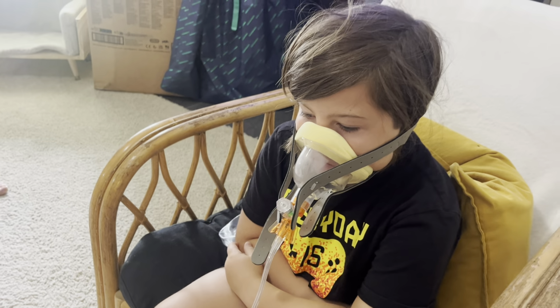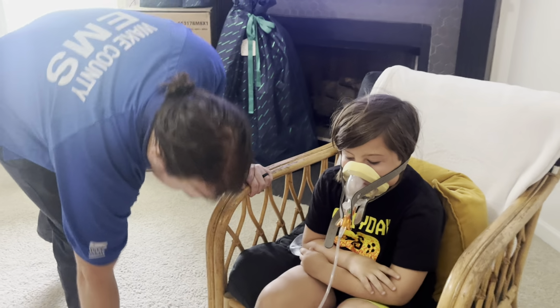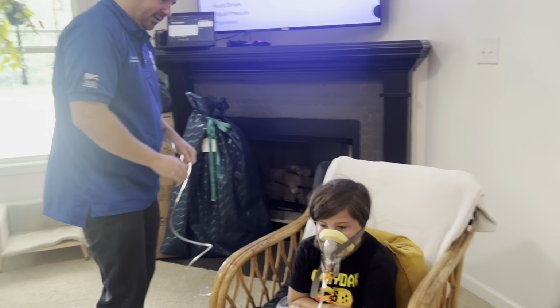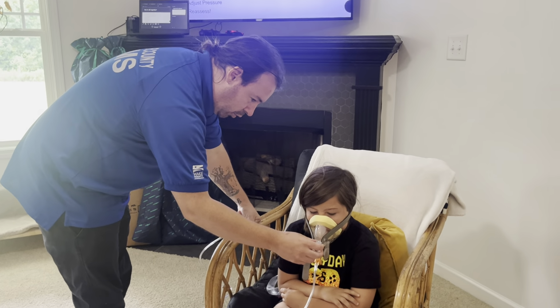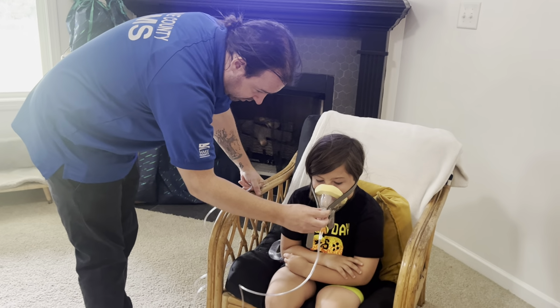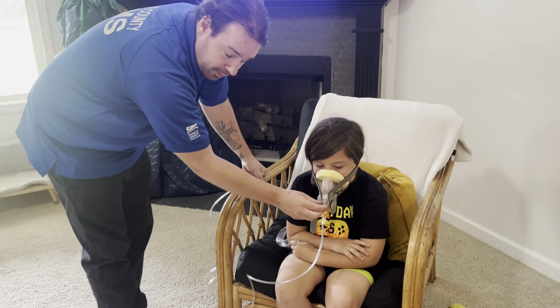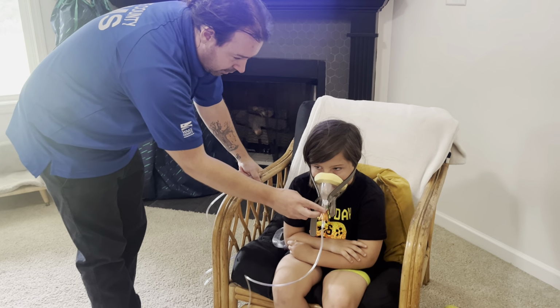So then from there, we just go ahead and change our pressure. So we have an easy flow. We've got it connected to oxygen. We'll say since he's having pulmonary edema, we're going to increase it to 15 liters a minute. And watch as this manometer ball comes up, and it should be sitting between 5 and 10 with that amount of oxygen flow. Okay, so then we set our pressure.